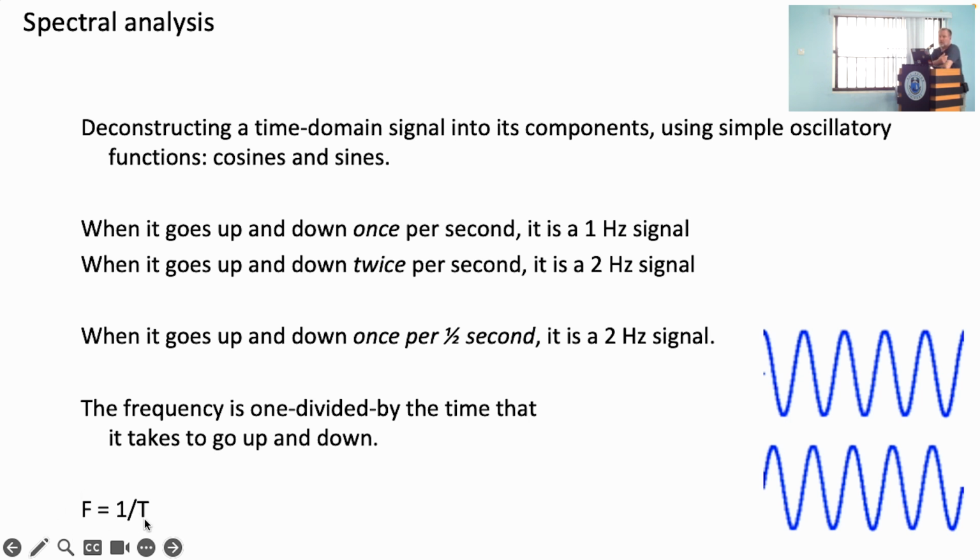This is something that we also used the day before yesterday when we were looking at the EEG. I recognized the alpha, and then someone asked, how do you know that this is alpha? What I did is I looked at the screen, and there were these vertical stripes indicating 1 second, and I counted the number of times that it went up and down. I counted approximately 10 bumps in the signal in 1 second, which means that it's a 10 hertz signal. And that's consistent with alpha. On top of that, I could see that it was on the occipital electrodes.